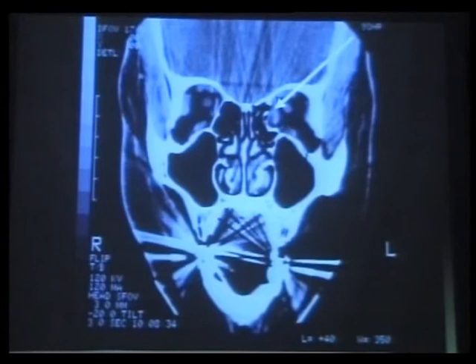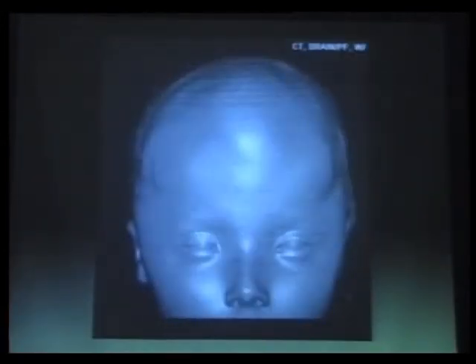So CT for ophthalmology and for neuro-ophthalmology is really good when you're looking at bone, so for instance in this medial orbital wall fracture, sinus disease, and orbit disease, because there's good natural contrast between the dark of air, the dark of fat, and the soft tissues and bone. So CT is still good for orbit. So if you need a fast study looking at orbital cellulitis or orbital inflammatory pseudotumor or thyroid ophthalmopathy, CT is cheaper and faster and gets the job done.